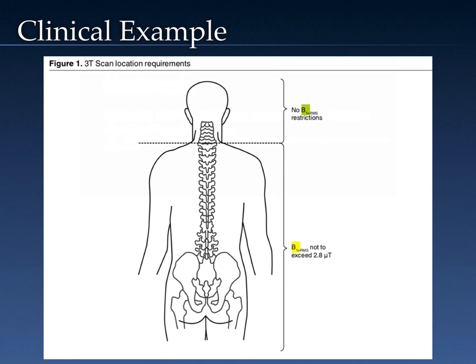The parameters which affect SAR will also affect B1+rms. So, therefore, if you wish to reduce the B1+rms, make changes to the sequence which will also reduce the SAR. So, for example, increasing the TR without changing the number of slices will reduce the SAR and will reduce the B1+rms.